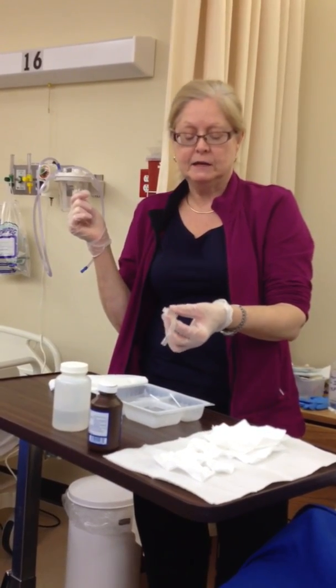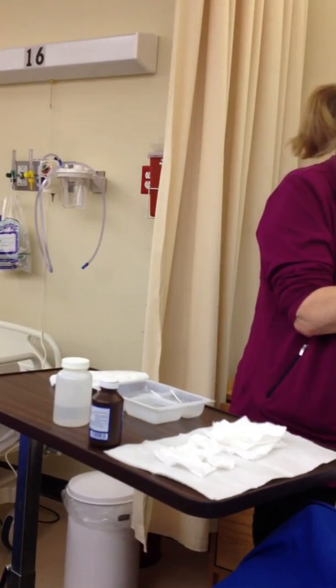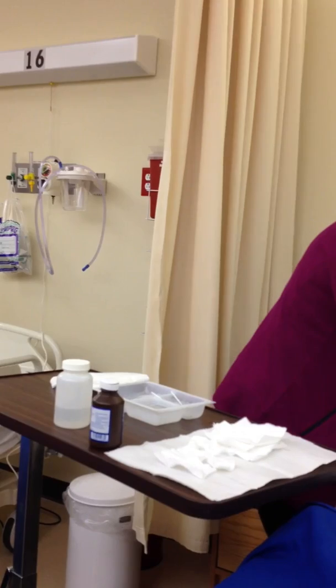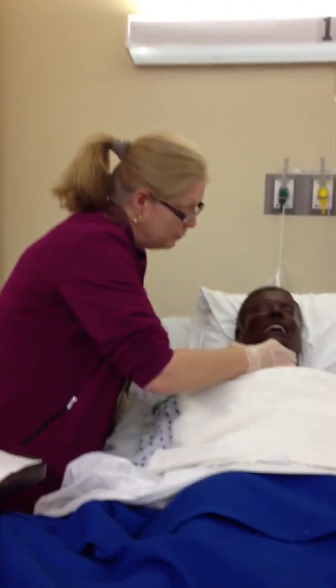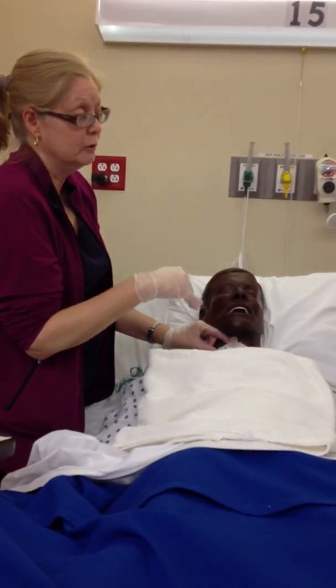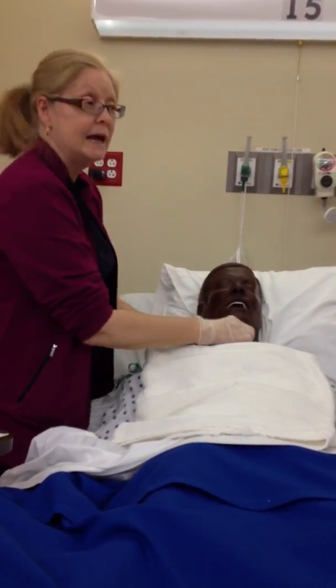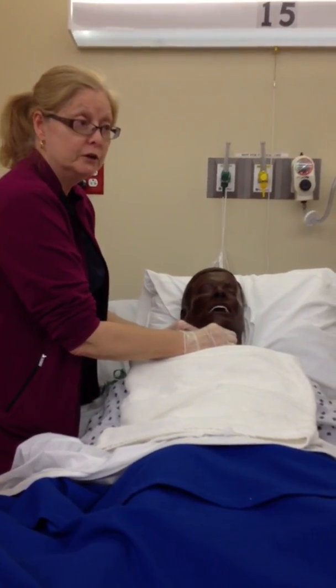Okay, and now we've got a good grip. You can switch hands to hold this plate steady, and we're going to put the trach back in. And that doesn't get dried off? Nope, we tapped it. The water actually lubricates the trach to make it easier to go down. And I heard it snap into place. And that's really important. Did y'all hear that?